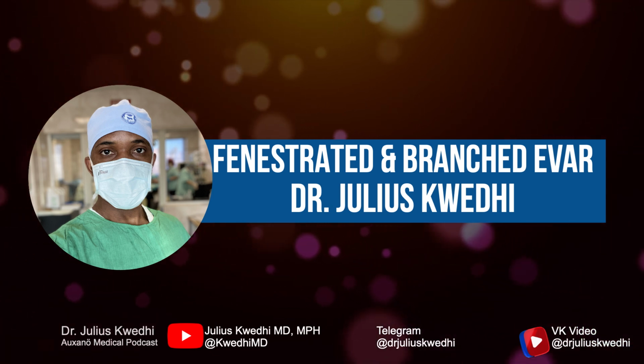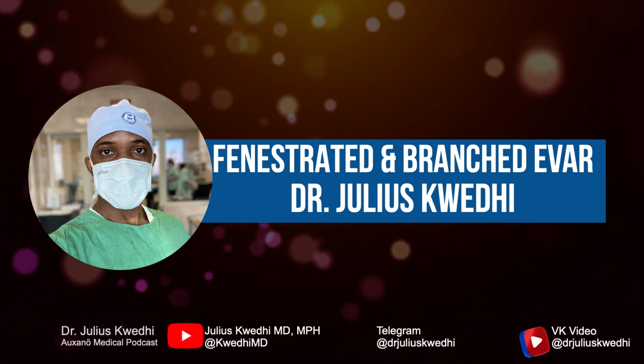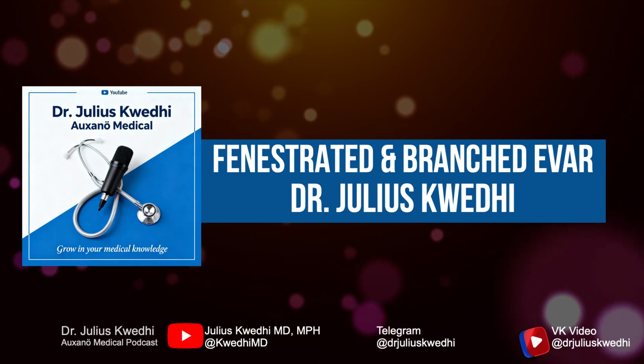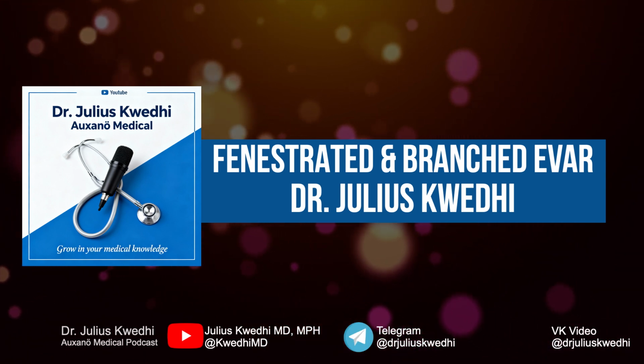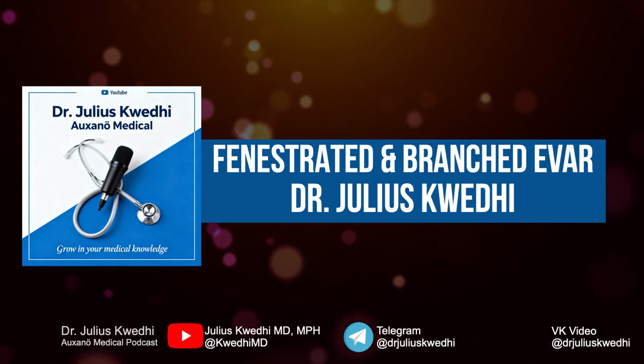Freedom from reintervention at 1 year ranges from 85 to 90%. Reintervention rates increase with time. Approximately 15 to 20% require secondary procedures by 3 to 5 years, but the majority are minor interventions, such as type 2 endoleak embolization or extension cuffs.